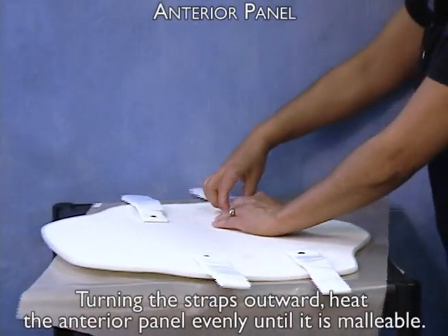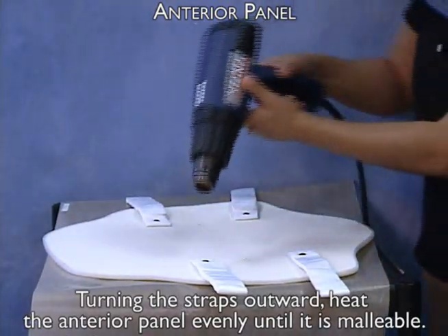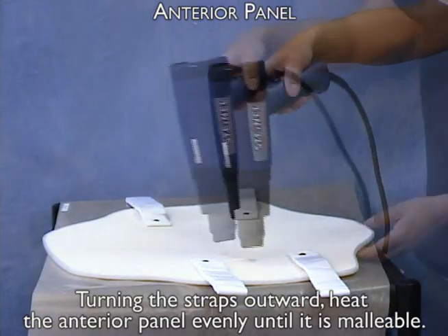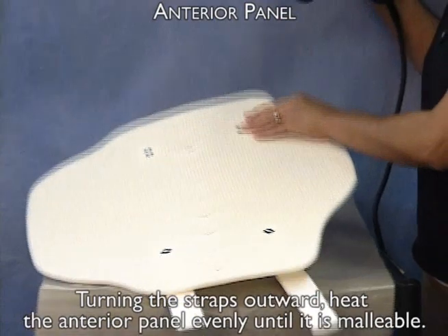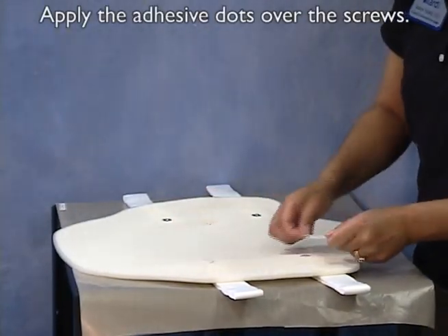Turning the straps outward, heat the anterior panel evenly until it is malleable. Apply the adhesive dots over the screws.